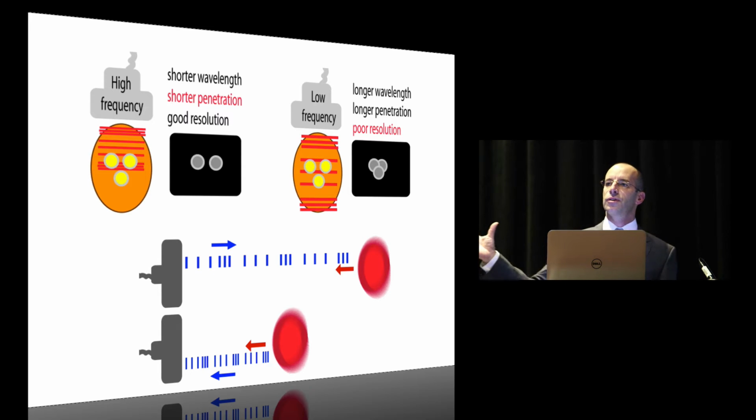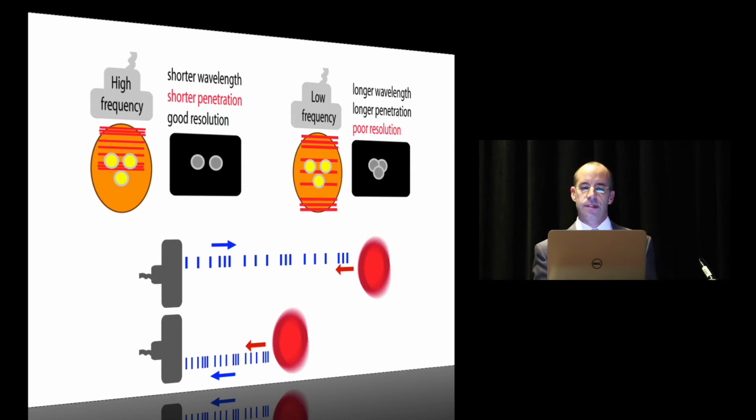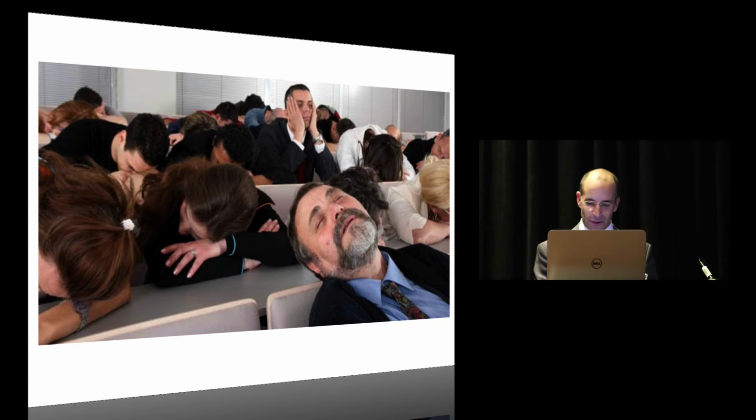As objects move towards the probe, it distorts the ultrasound such that you get some compression of the waves, and that Doppler shift is appreciated by the probe, the same way as if a car drives past and you hear it going, meow, same sort of effect. All right, so that's physics done, and I thought I'd end off there, otherwise we'll have you all pretty much done.